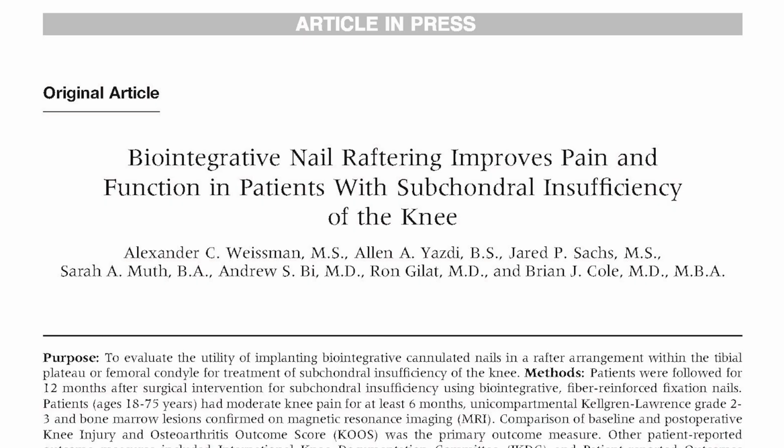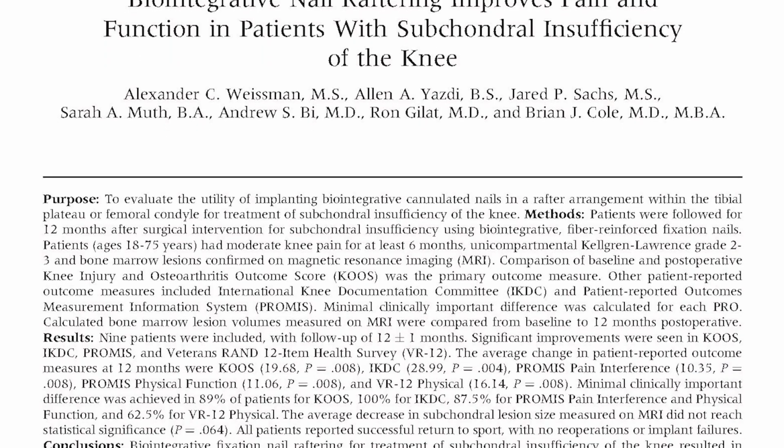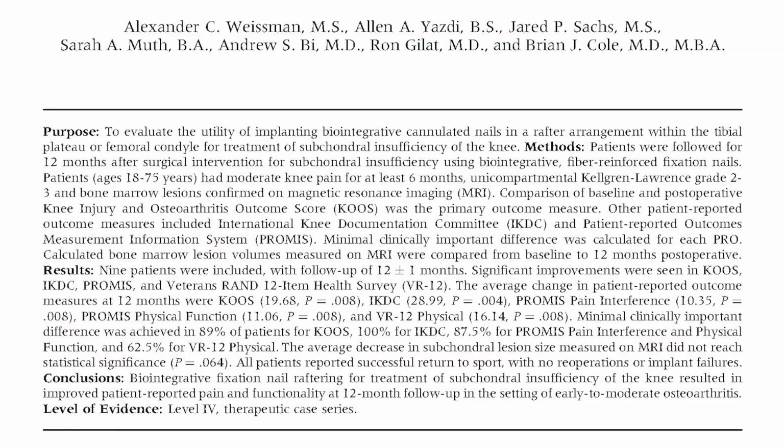The KneeBar procedure, I think, adds something to our armamentarium for a patient population that has otherwise been quite vexing. The feedback from our patients, which has been nearly uniformly successful, is that they've seen substantial reductions in pain, improvements in outcome, and they recognize that they really had no other alternatives, having exhausted non-surgical treatment and knowing that they're not candidates for anything more, such as arthroplasty or knee replacement.